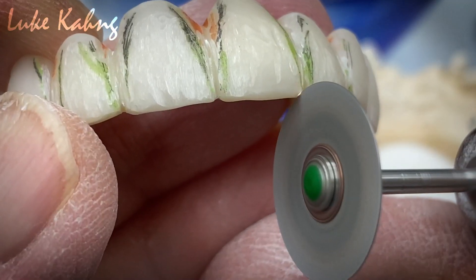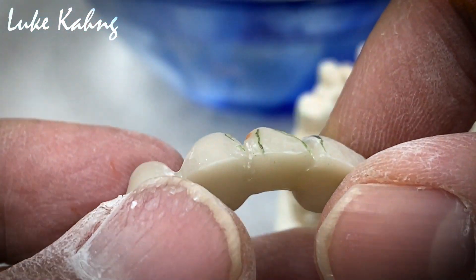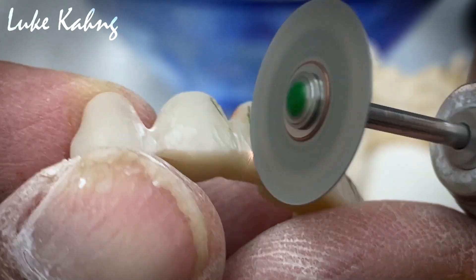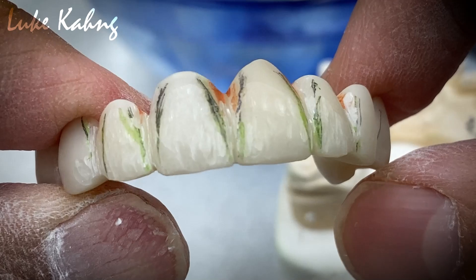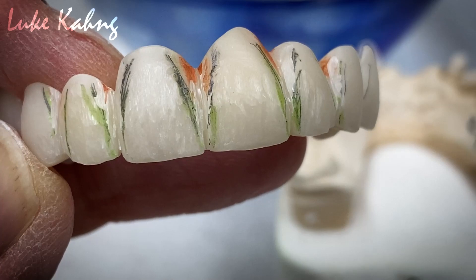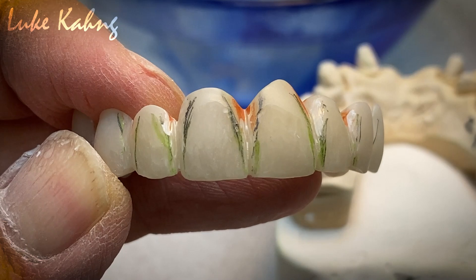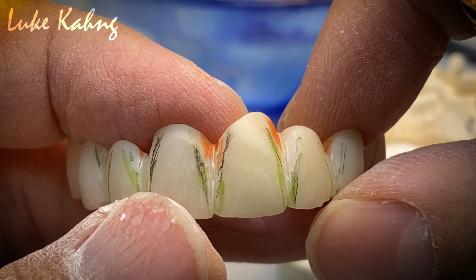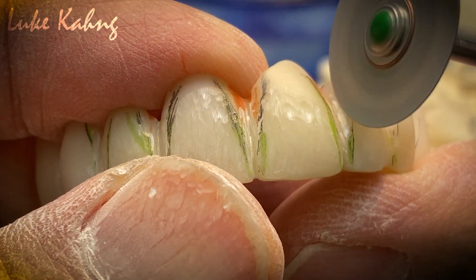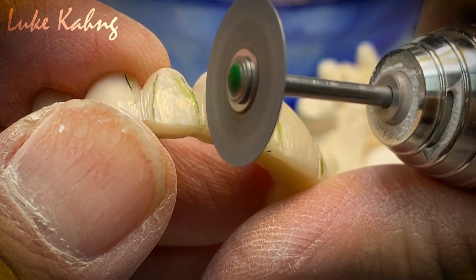It's a little bit feminine looking — just a little bit, just a little warmer. That's the contour design from the green state.